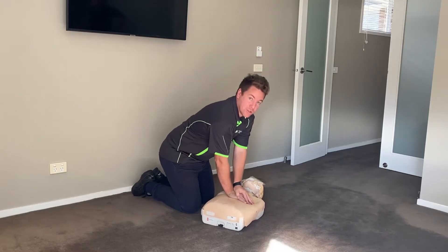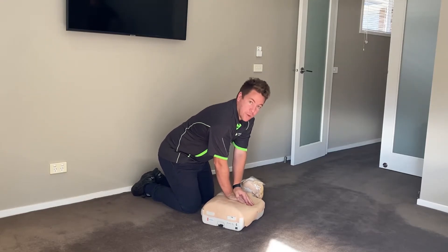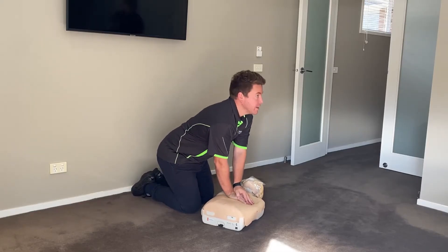It is important to note that a defib machine should only be used when there are two people. This is to make sure that you never stop compressing the chest. Frances, can you please grab the defib machine?